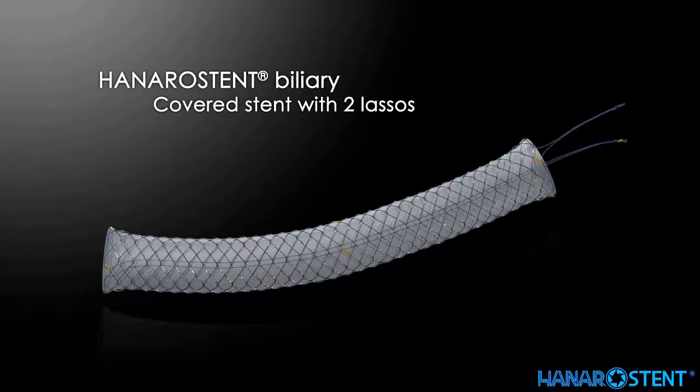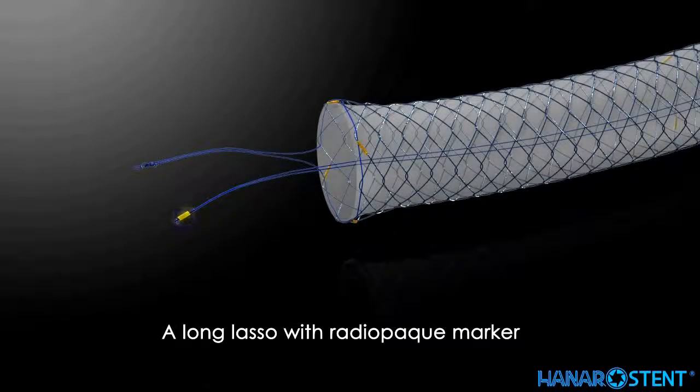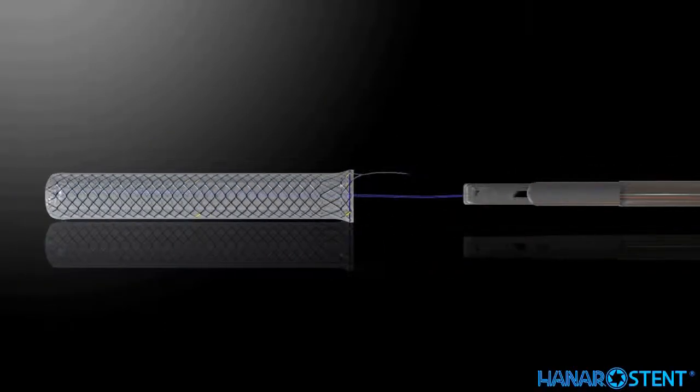This is the covered stent with two lassos for inverted removal. By pulling the long lasso, indicated by the radiopaque marker, the stent will be inverted and safely removed.